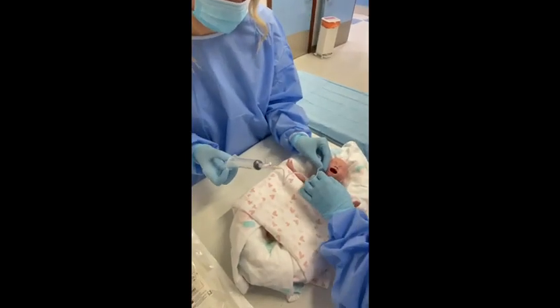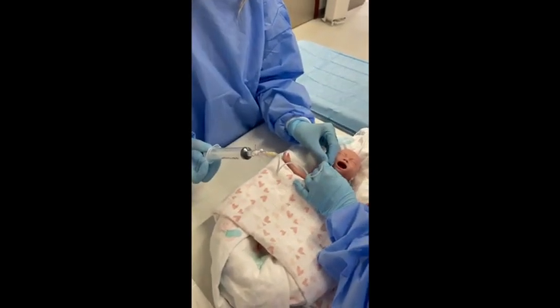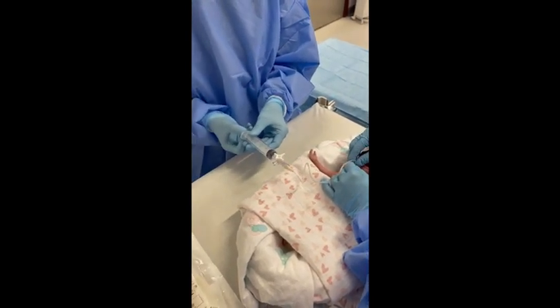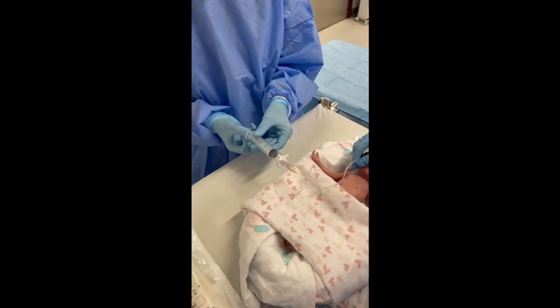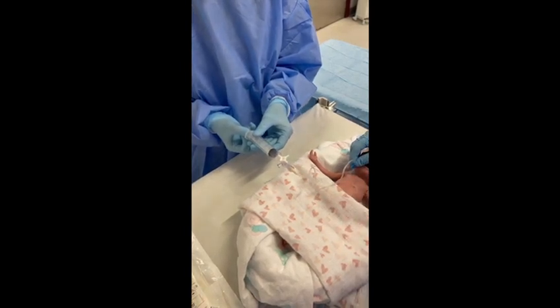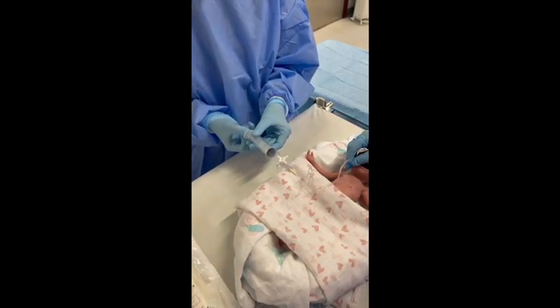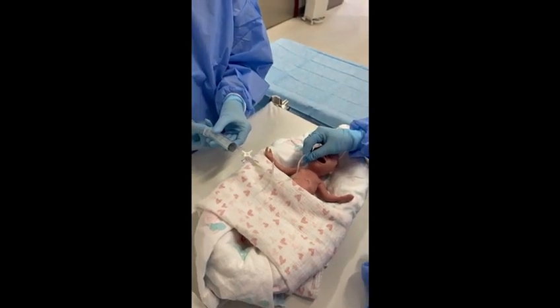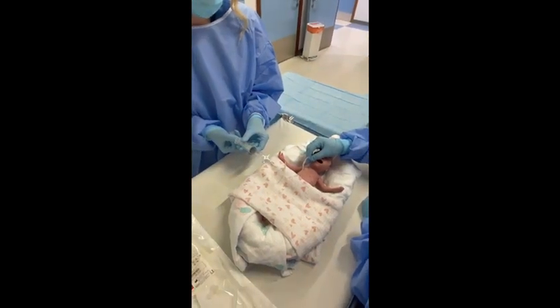Insert the butterfly needle into the second intercostal space in the mid-clavicular line, thereby avoiding the nipple. Advance the needle until air is aspirated. Stabilize the needle with one hand and use the other hand to manipulate the syringe and the 3-way tap.